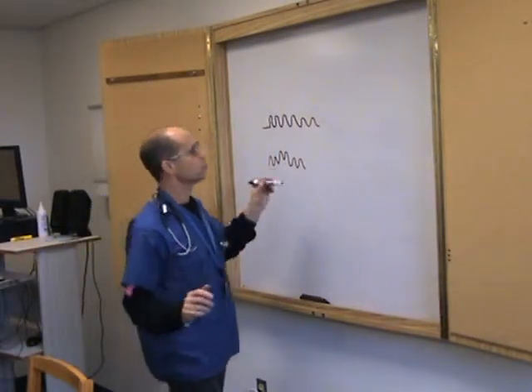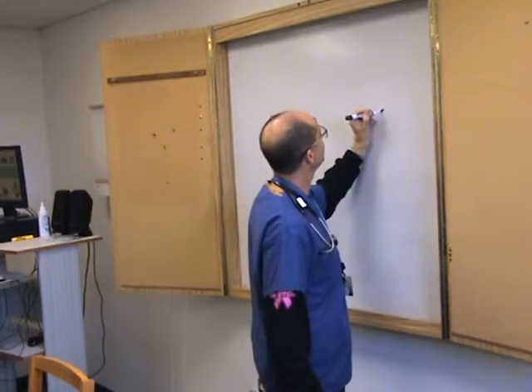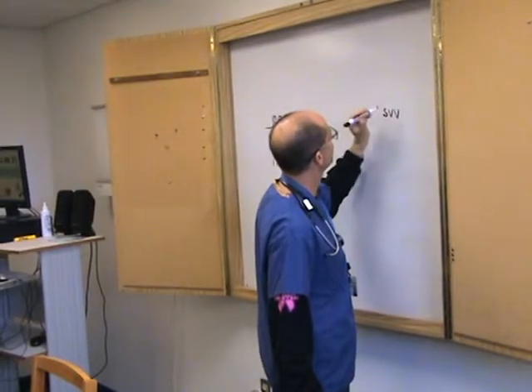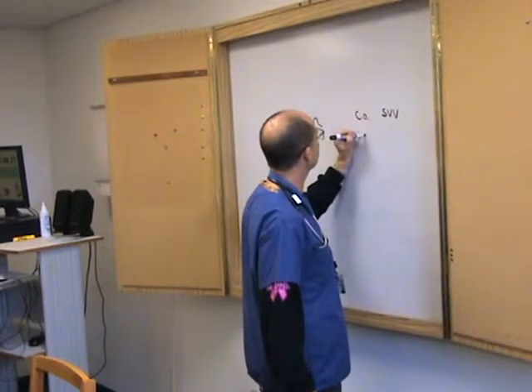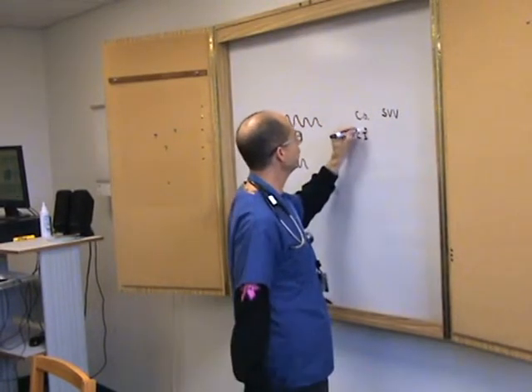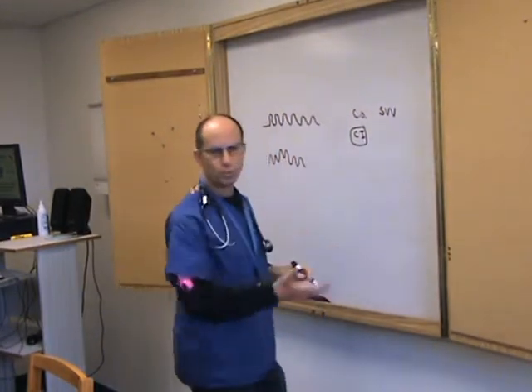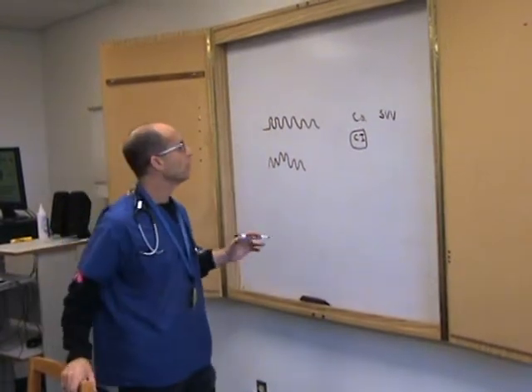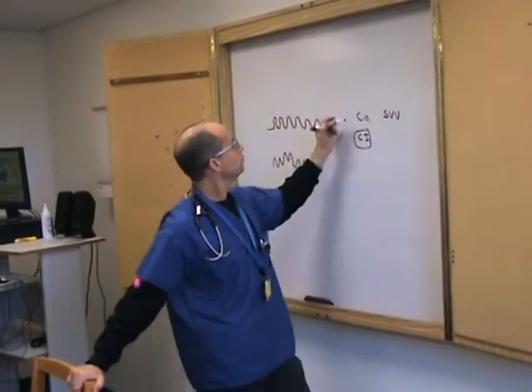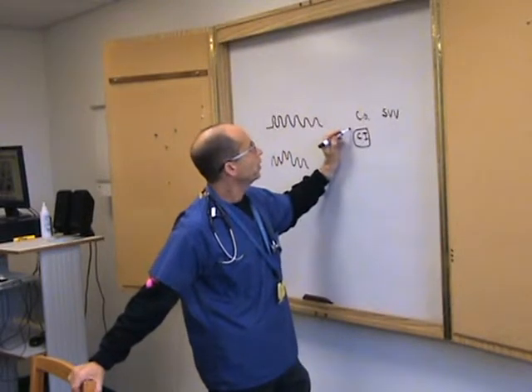So what the flow track does, that reads out on an instantaneous basis, and it calculates a number. So the main numbers you've got to worry about are the SVV, the cardiac output, and cardiac index, because cardiac index is more accurate since it's adjusted for body surface area. You can have a small person that's got a cardiac output of 4 that's adequate, and a big person where it's not very good. So cardiac output, cardiac index, and SVV.